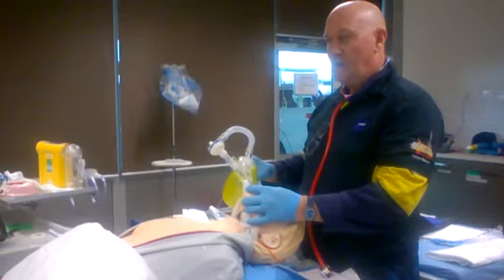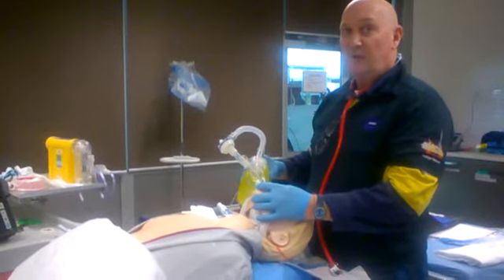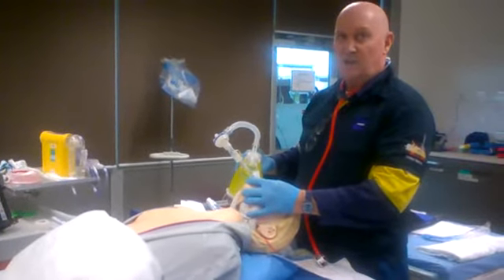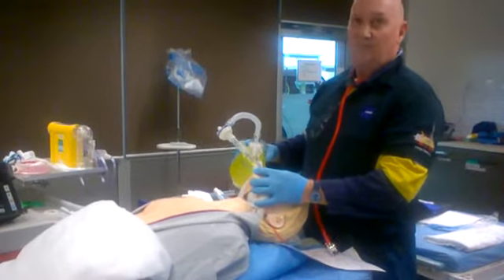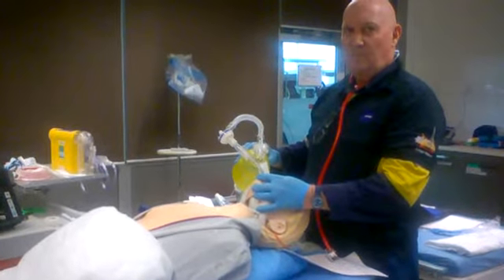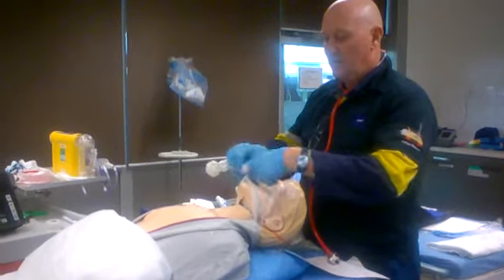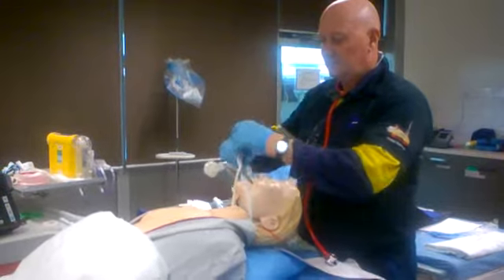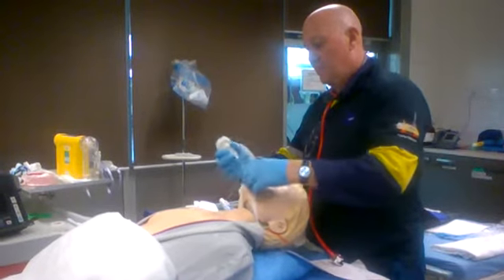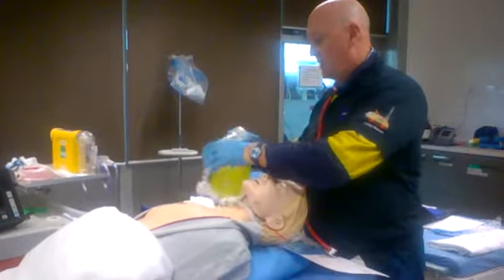Alright? So, while we're monitoring the patient, we're monitoring the capnography at 35 to 45 PCO2 on the ventilator. We're also taking into account that we've then got to look at post-intubation care. This may involve some more midazolam and fentanyl. So if we get a problem where we can't get the tube down or anything, or the tube's failed and the tube is taken out, cuff deflated, and an oral airway is inserted, then we go back to bag mask ventilation.